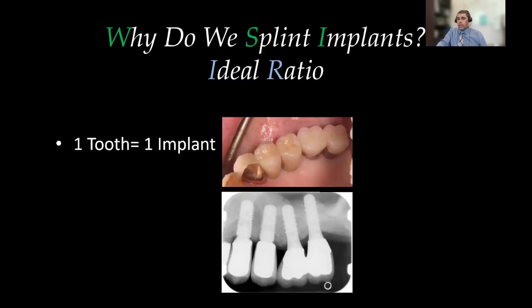But that's sometimes an overkill. Sometimes, you don't have the bone structure there. Obviously, there are financial limitations. But if I can place good size implants, lengthwise, widthwise, I can actually eliminate and stagger the segment and consider the pontic. But I shouldn't go more than every segment more than the width of that implant. Meaning if I have two implants, I probably can skip one segment and substitute that with a pontic.